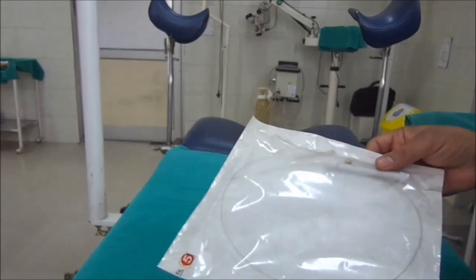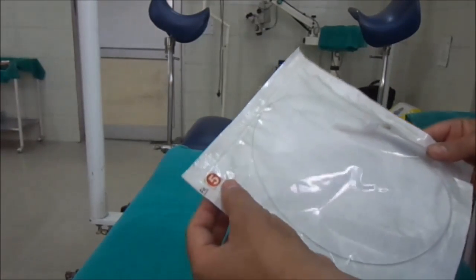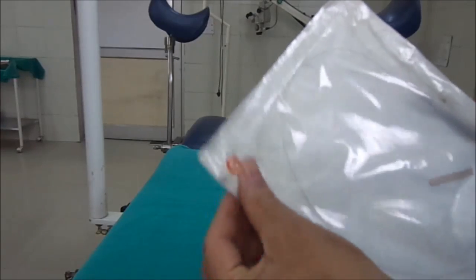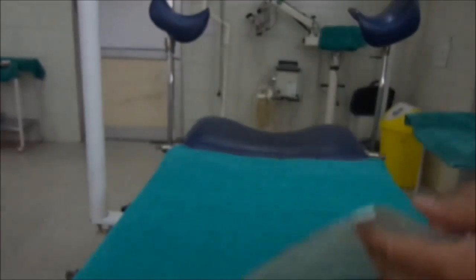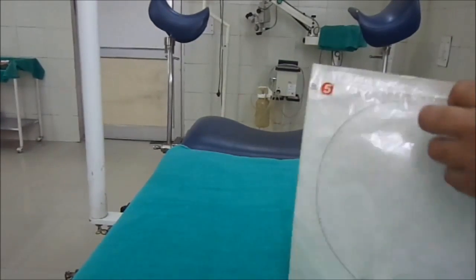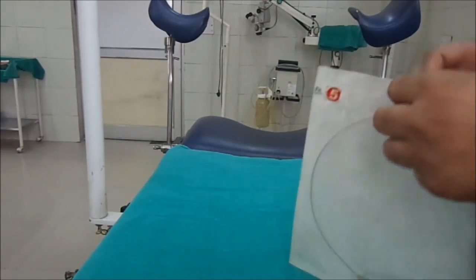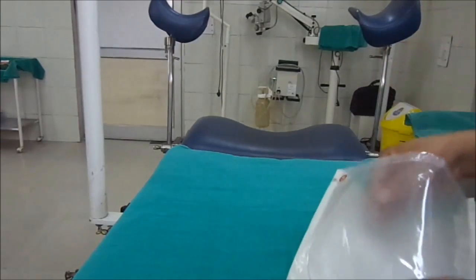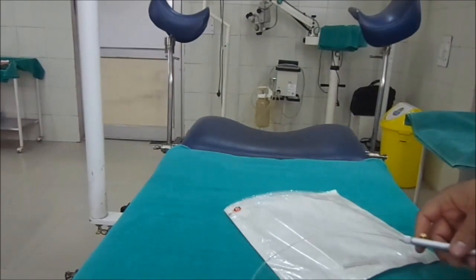This is the Dormia basket, used for stone extraction through cystoscopy. It is used to extract small-sized stones from the urinary bladder and even from the lower part of the ureter.